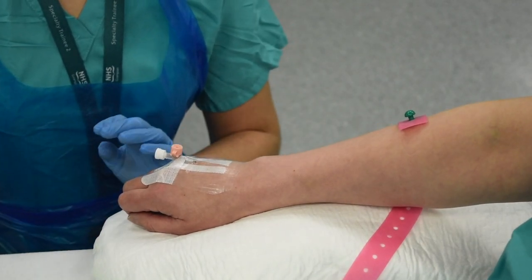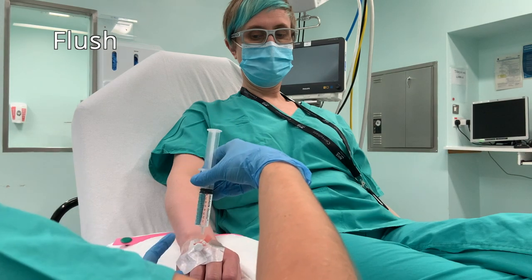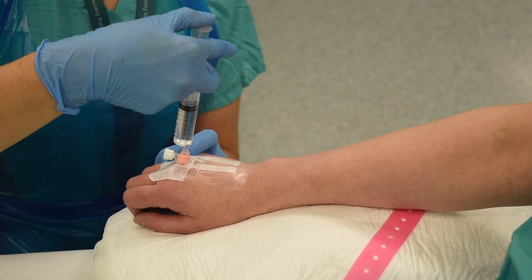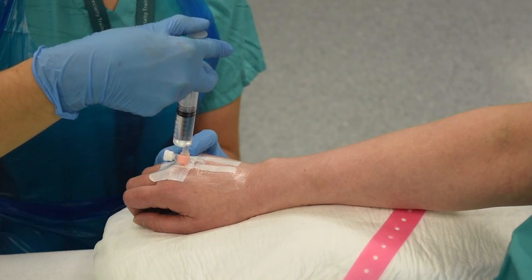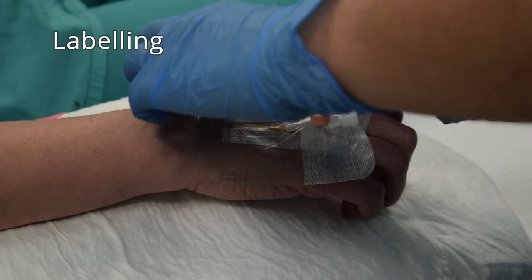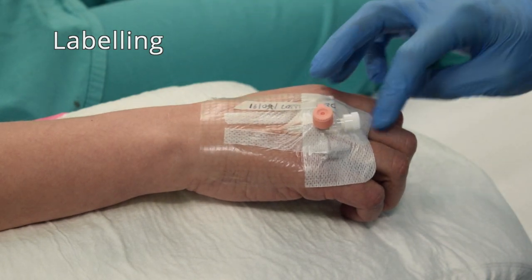Once all of this is done, take 10 mls of 0.9% saline and flush through the Venflon. It should be painless, although a cold sensation of fluid going up the arm is normal, and there should be no swelling at the cannula tip site. The final step is to apply the date, time, and your initials to the cannula dressing.